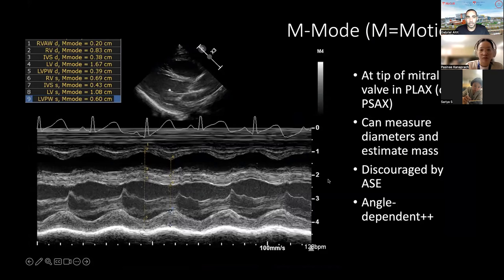This is now a Philips image where you have the line of interrogation here. And you can see that, at least for this machine, the line of interrogation also provides you information about the distance. This is 1 centimeter from the probe, this is 2 centimeters, this is 3 centimeters, this is 4 centimeters. These dots represent a distance. Here we can also see where we've put the focus, and P for Philips, because that's their particular machine, is the representation of where the cursor is.